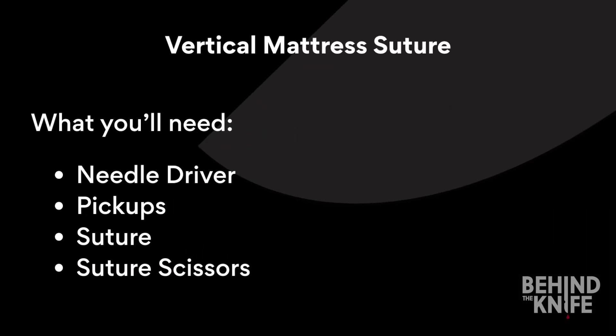Today we're going to learn how to perform a vertical mattress suture. For this suture you will need a needle driver, pickups, suture, suture scissors, and your behind the knife suturing board.